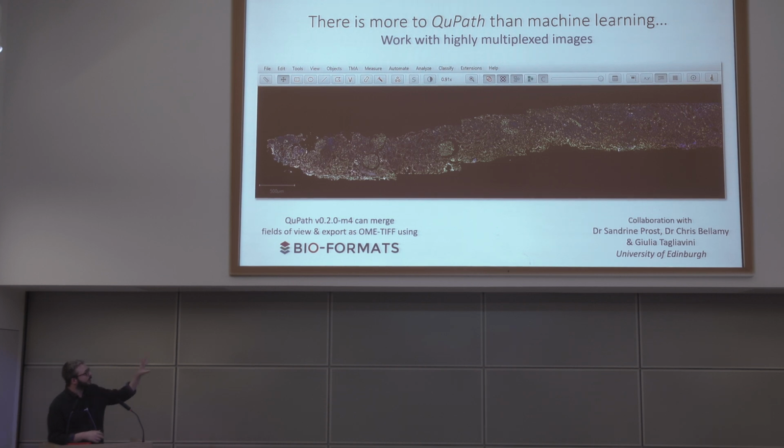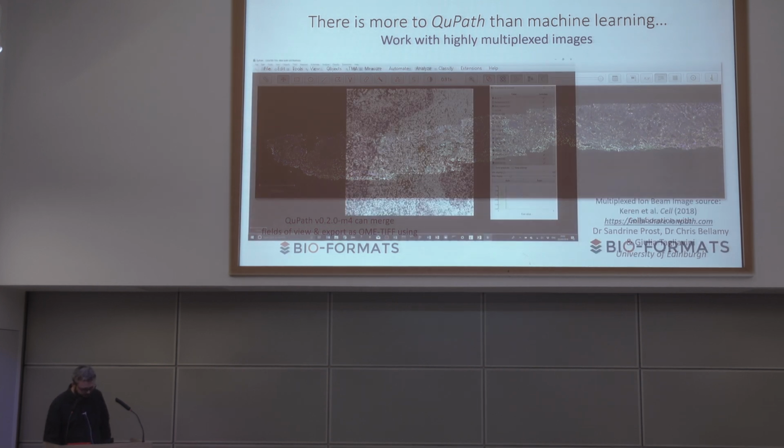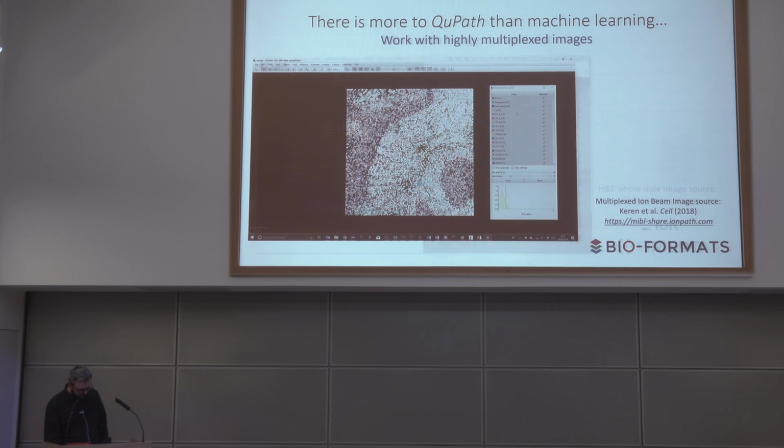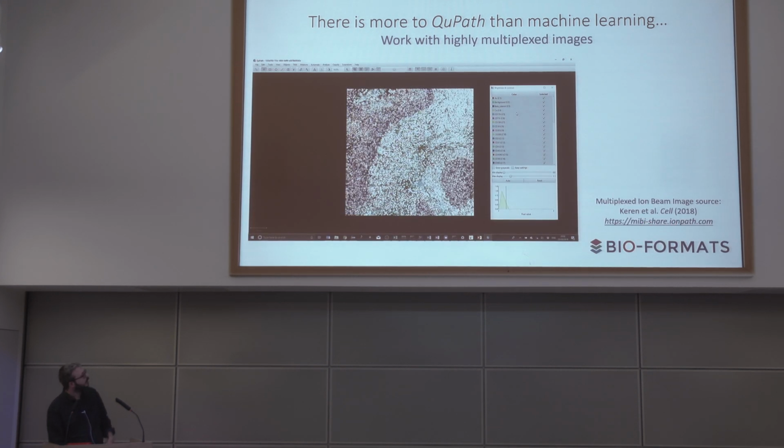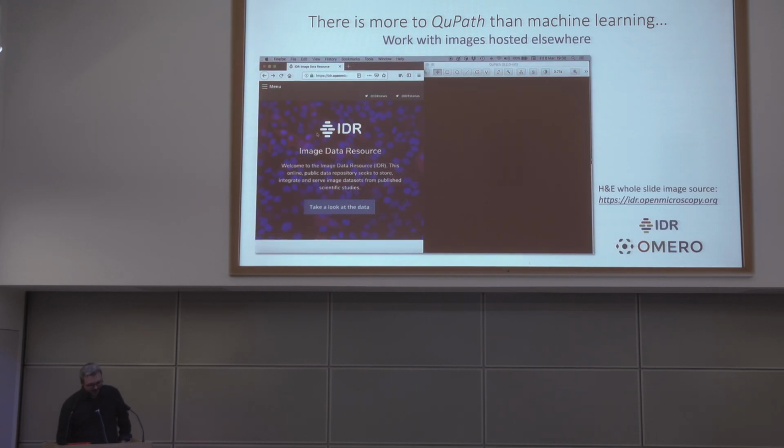So you might know about Bio-Formats if you work with images at all, led by a group in Dundee. And so they have come up with an open file format to represent images in pathology, and QuPath then can use their library to write the images, and it can stitch together different fields of view to give you this data. And this was the example I just showed. It was originally supplementary material, I think, with this paper, which I was not involved in, I should point out.